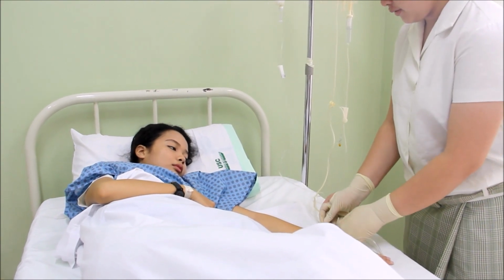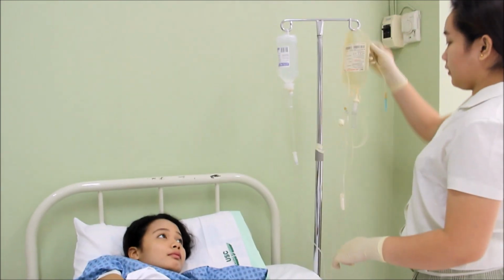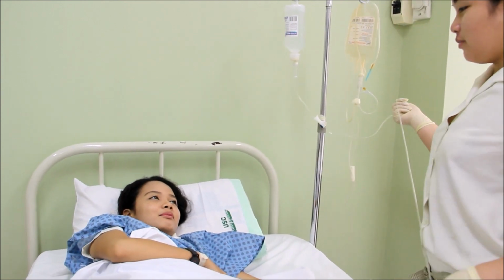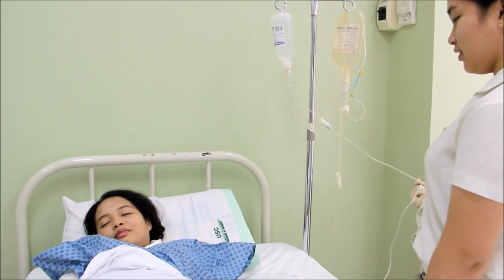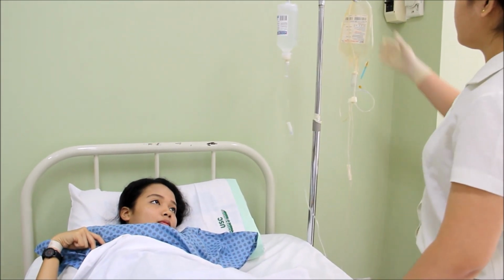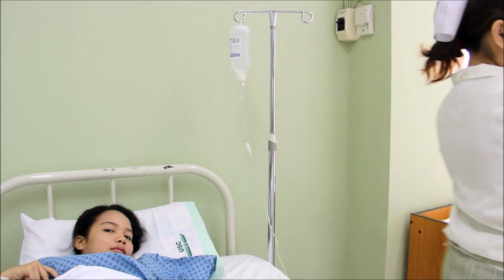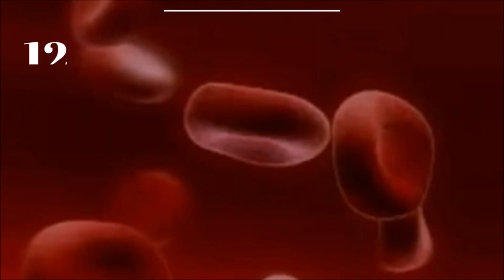If the primary IV is to be continued, flush the maintenance line with saline solution. Disconnect the blood tubing system and re-establish the intravenous infusion using new tubing. Adjust the drip to the desired rate. Often, a normal saline or other solution is kept running in case of delayed reaction to the blood. Again, monitor vital signs.